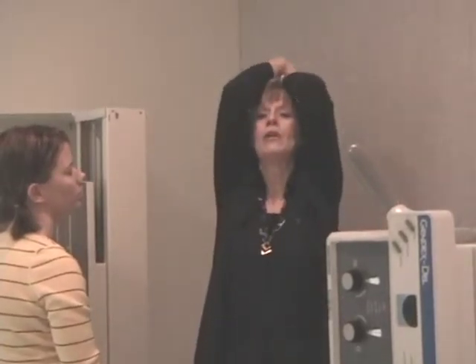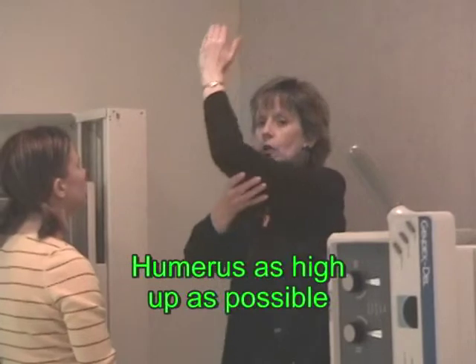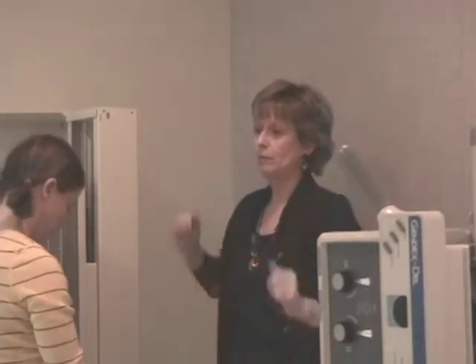This is probably more real world, what you're going to want to do. Elbows forward, chin up. Try to get the humerus as high up as possible. If the humerus are not up, you're going to have soft tissue into the lung fields. But there are going to be times that you are not going to be able to get that arm up much higher than this. There might be an IV pole in the room that the patient can hold on to. There might be a pulley system that they can hold on to. Be creative. Try to get those arms up. Do the best job that you can.